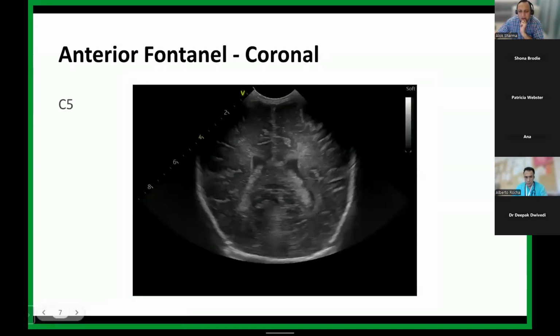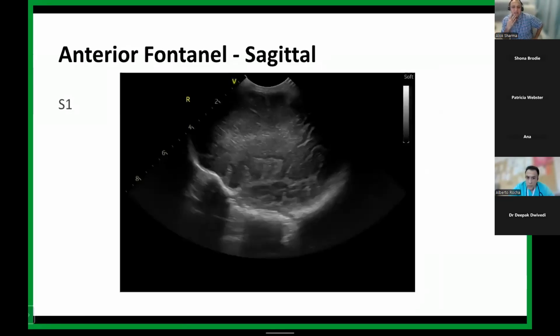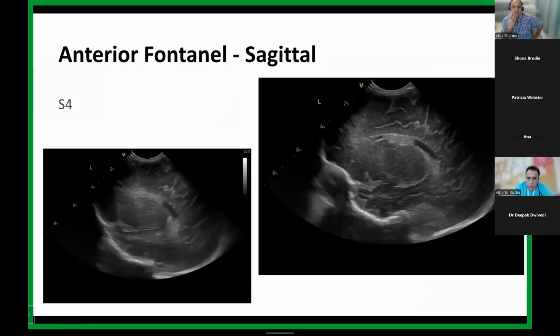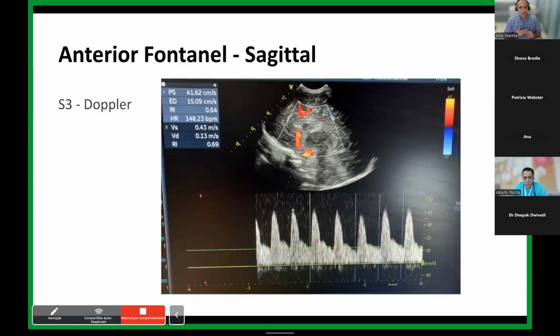So, arteriovenous malformations, you'd probably see something cystic and pulsatile in the brain; put vascular Dopplers on it. To me, this looks like bilateral grade ones, definitely with echogenicity on that left side. It would be very interesting to follow and see whether this evolves into a parenchymal venous hemorrhagic infarct on that left side with time going forwards. And an MRI with an MRV and an MRA would definitely be indicated to make sure that he's not stroked on that left side.